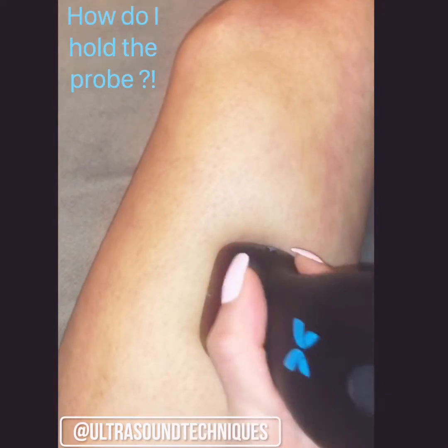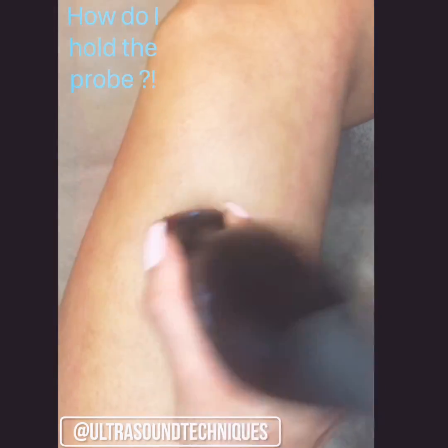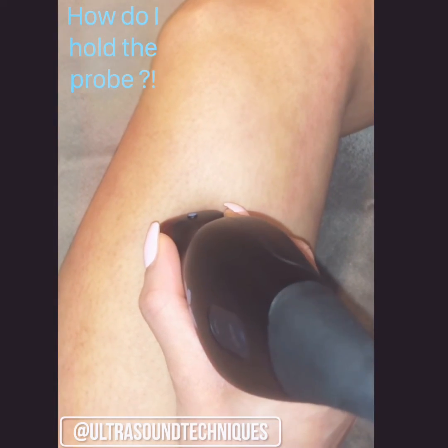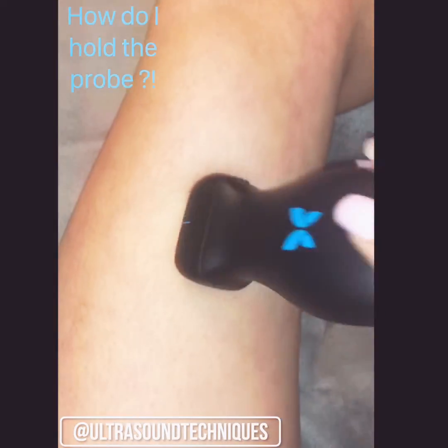You can get optimal images holding it closer to the skin, especially if you want to apply a little bit more pressure. If it's a difficult scan, sometimes the patient is in a position where you have to hold it a little bit higher to get your arm and wrist up a little bit more.